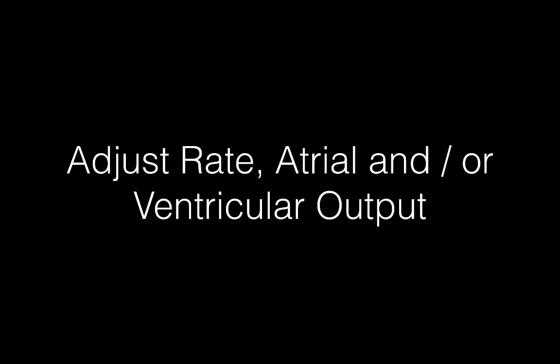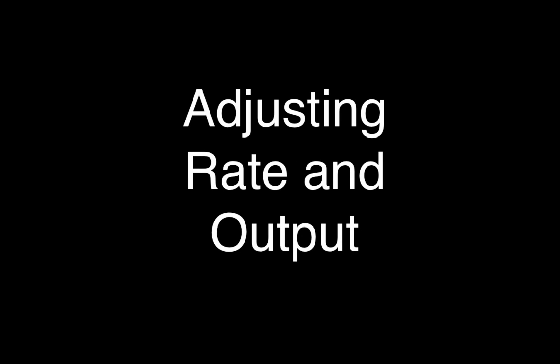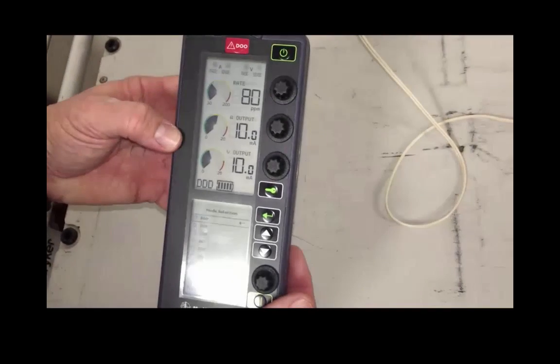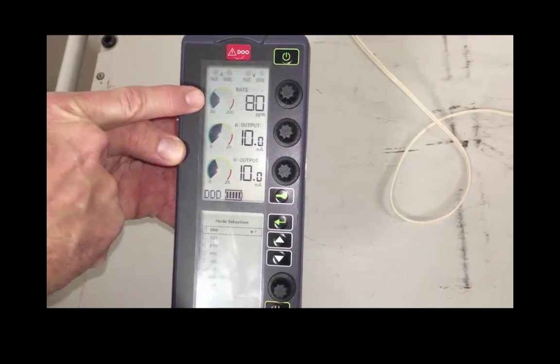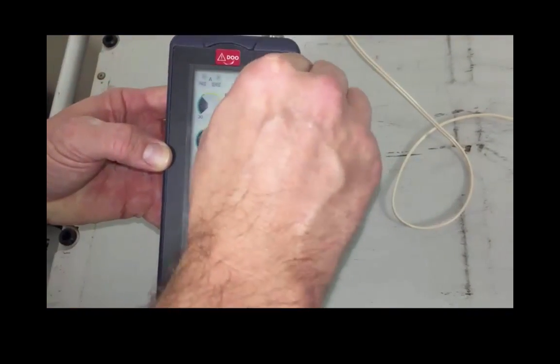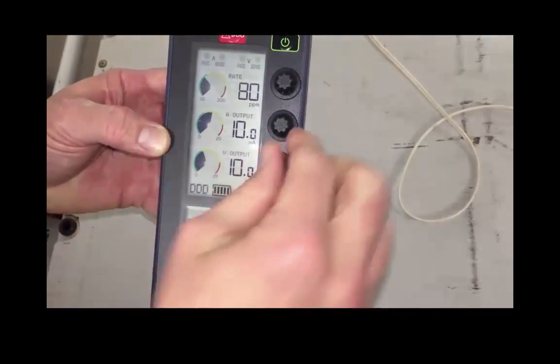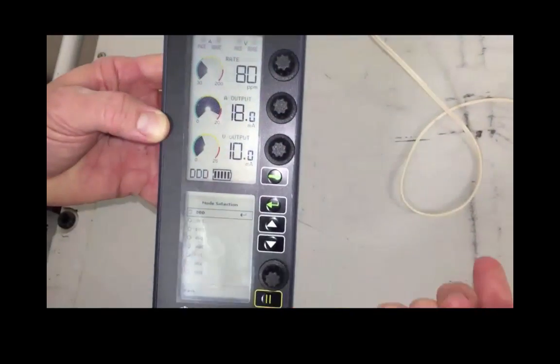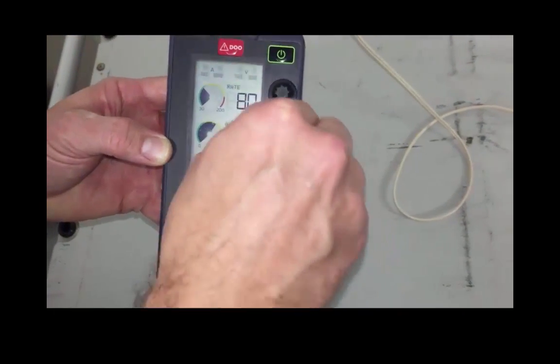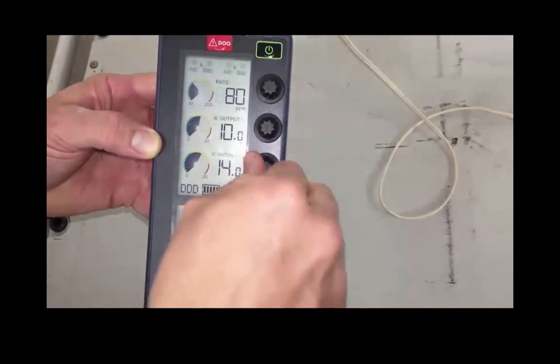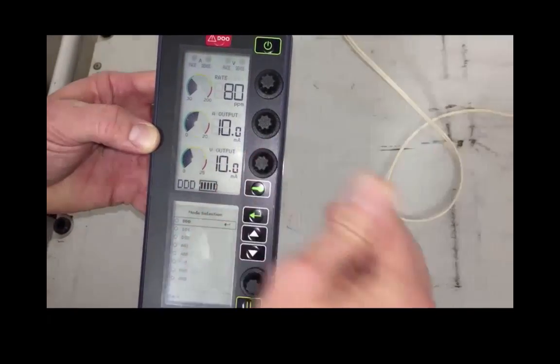So now we're going to talk about adjusting the rate, the atrial, and or the ventricular output. That's going to be using the upper screen menu system. Adjusting rate, atrial, and ventricular output are pretty straightforward. On the upper menu, there is an area for rate, atrial output, and ventricular output with a corresponding dial. Turn the dial clockwise to increase, and turn the dial counterclockwise to decrease. Remember to assess for capture by looking at your monitor screen as well as your patient's clinical response.